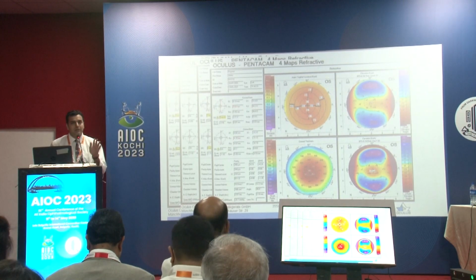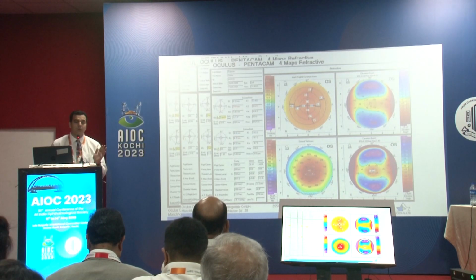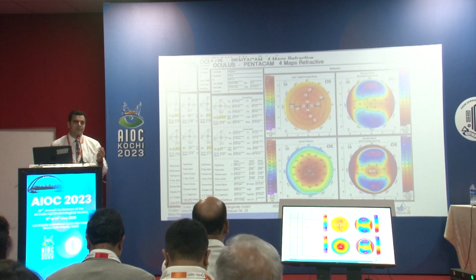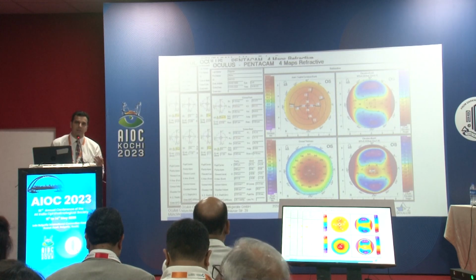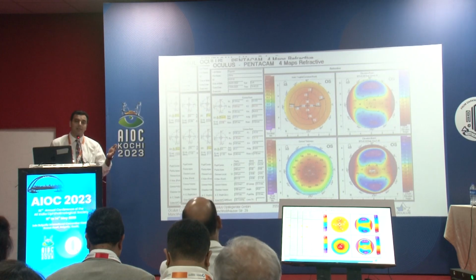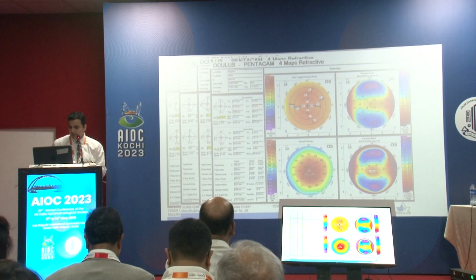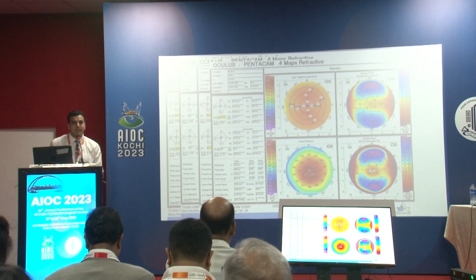One more challenge that we face here is that K values are 58, 61, 64. These will give you an ACD which is falsely very high. Always deduct some amount of anterior chamber depth and then send it for calculation. Suppose your ACD is showing 3.6, that's a false ACD. Send it for calculation as per a 3.3 millimeter ACD, so that you get a lens which has a fairly normal vault as compared to what you would otherwise land up with.